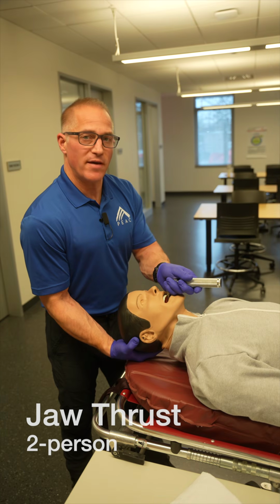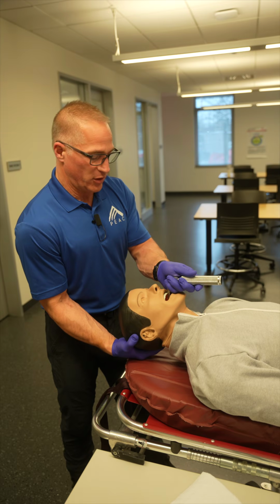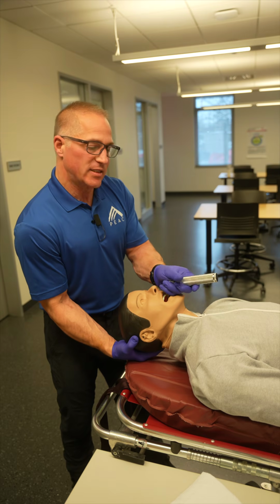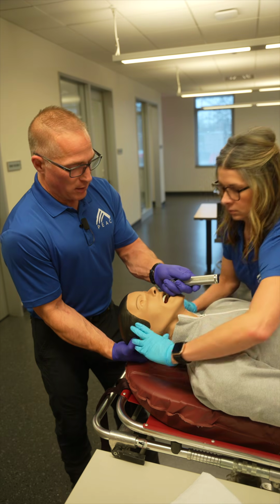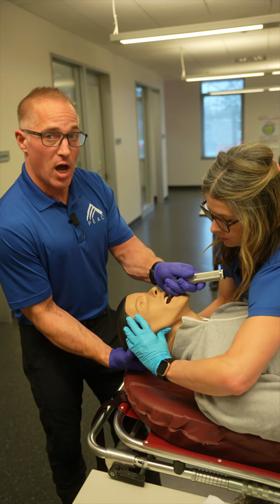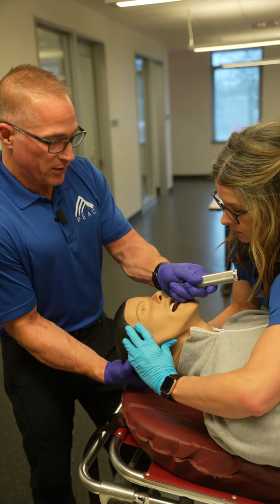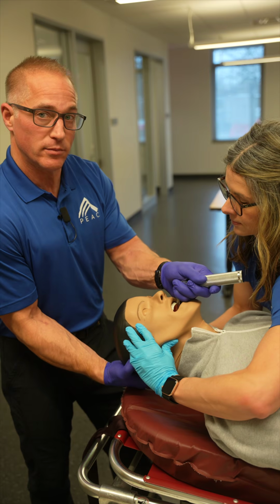All right, now that we have the patient in the proper position with flextension, lifting the patient's head, we can now add a second provider's assistance with a jaw thrust. Your partner comes in from the front and simply provides a BLS jaw thrust maneuver, thus exposing the epiglottis to a perfect view for intubation.